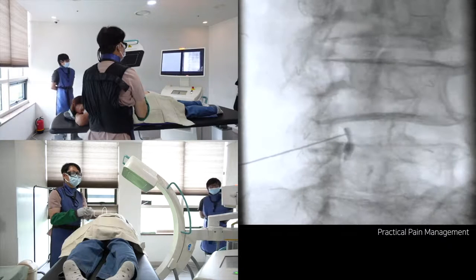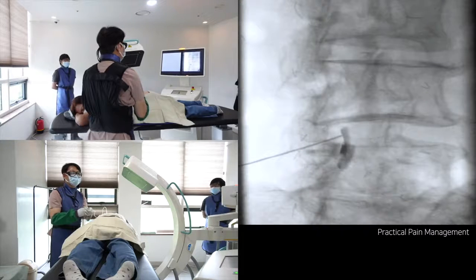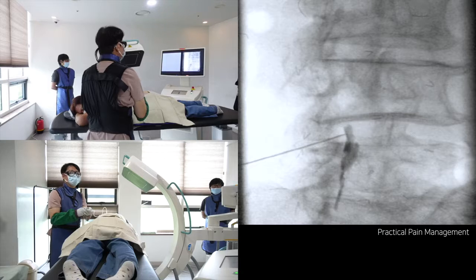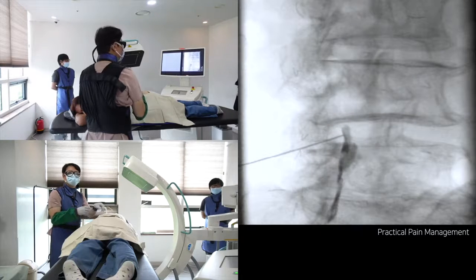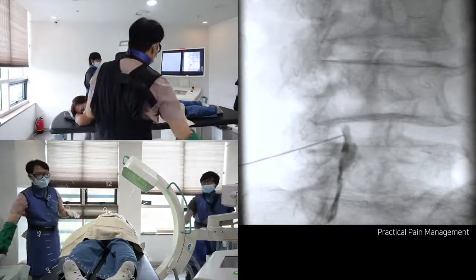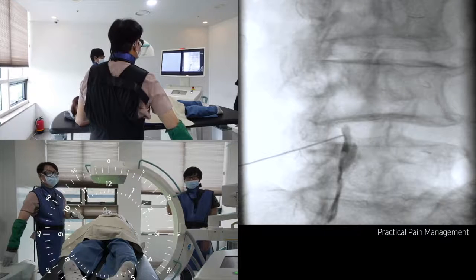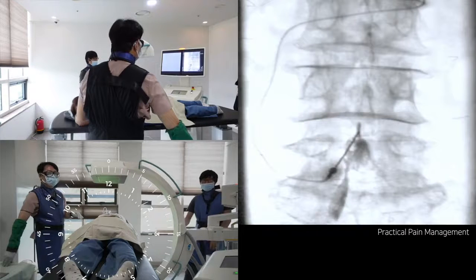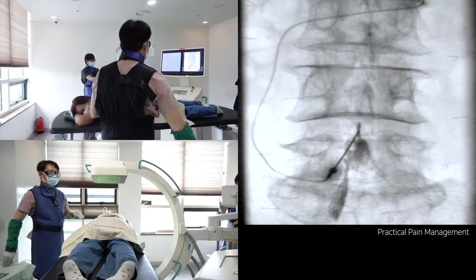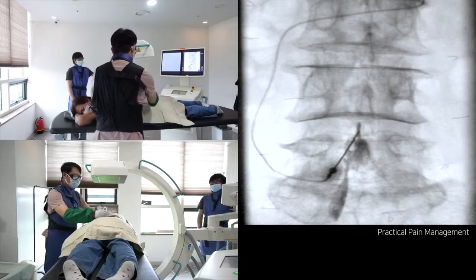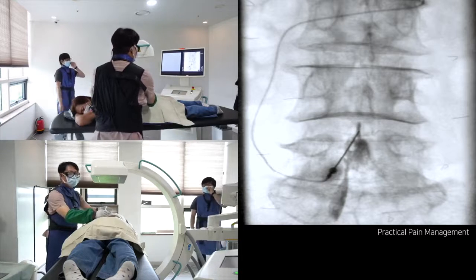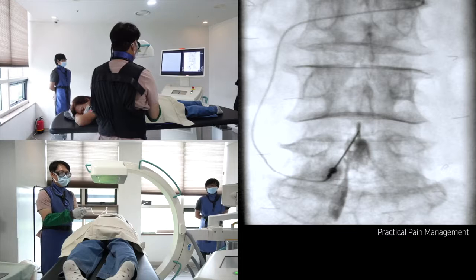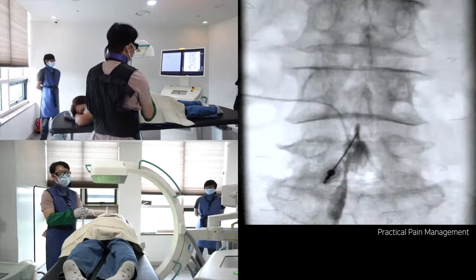The small vertical leaks of contrast assure you of the posterior epidural space. However, I try not to use the interlaminar epidural approach in patients with previous laminectomy, which has no epidural fat space and is replaced by granulation tissue. There is a high risk of dural puncture at the laminectomy level. I do not go to another side if it is a midline epidural space, but I add another side approach in the perisagittal approach when showing only one-sided contrast spread.